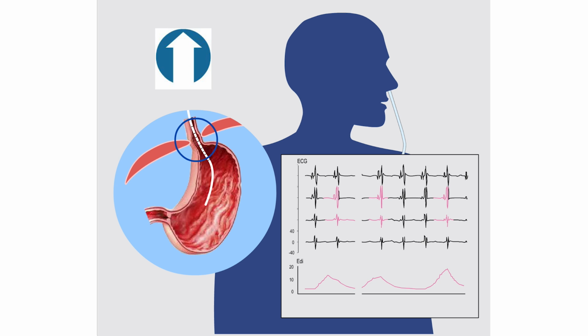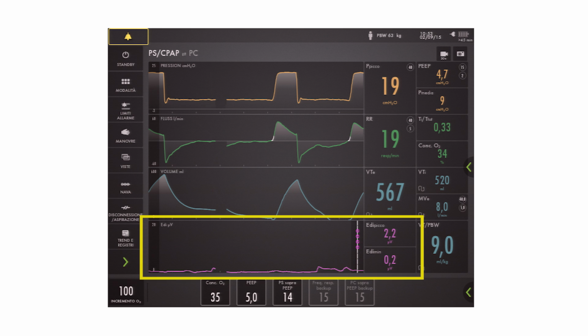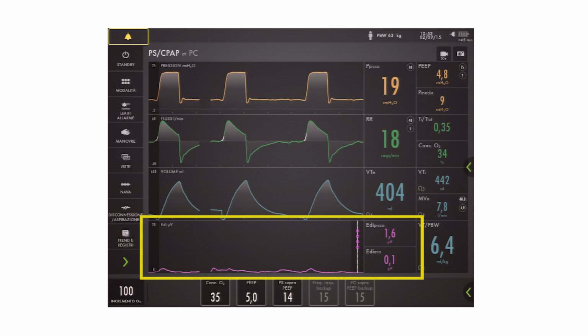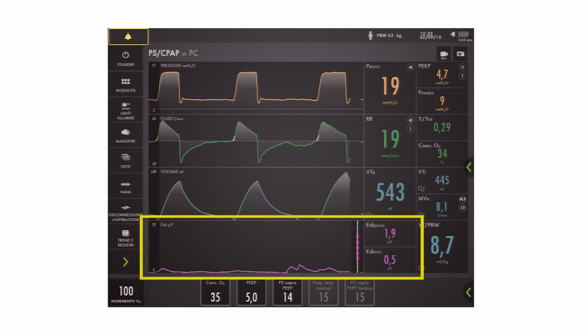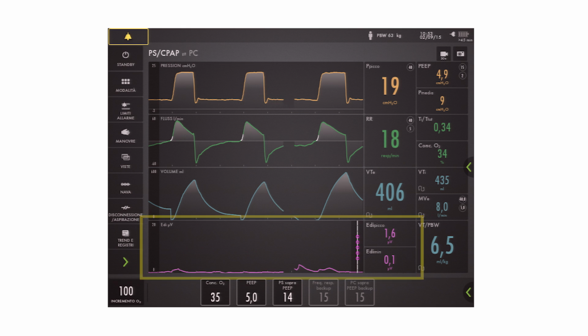The pink indication can only be used if there is a stable EDI signal. If the EDI signal is very low or absent, there will be no pink highlights. An absent or low EDI signal may be due to hyperventilation, sedation, muscle relaxants, or neural disorders. If the respiratory drive becomes inhibited, the EDI catheter can stay in place until the EDI signal is reestablished.